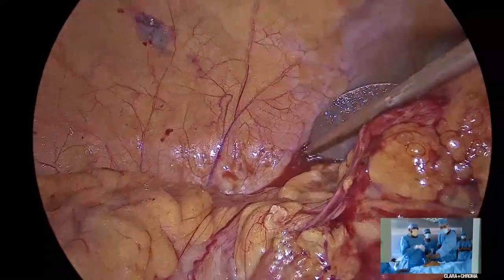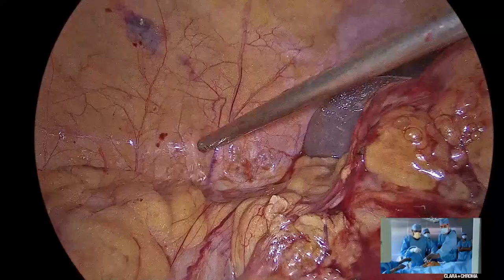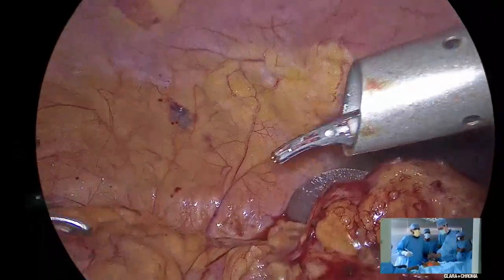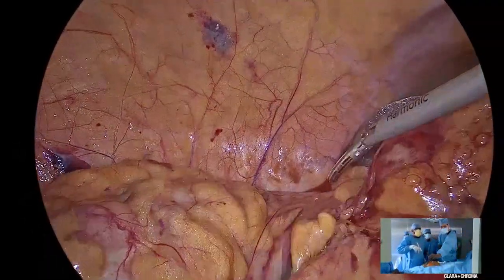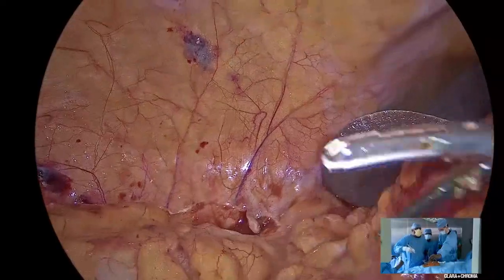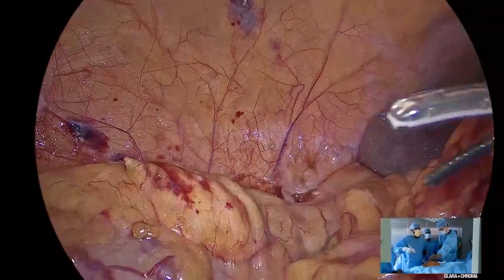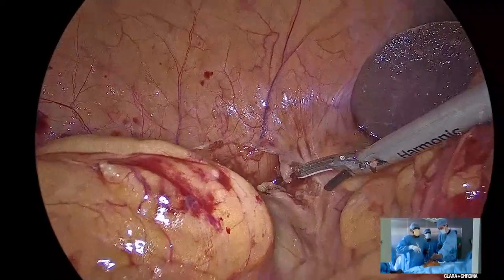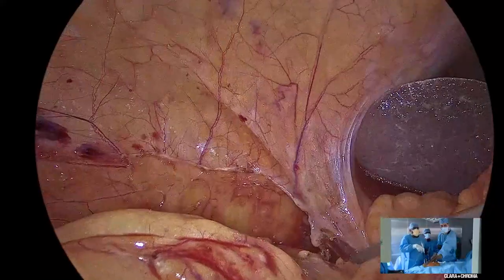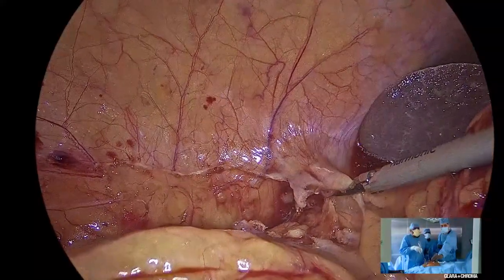Basically, we need to follow the embryonic planes, and we need to go in the fat planes between the SMV and the SMA. Go all the way up, get the colic branch of the gastrocolic trunk of Henle, and bring the transverse colon down, which gives you access to the uncinate process. Take all the fat underneath the uncinate process, and then complete your resection. But the ileocolic artery ligation is exactly at the point where we have just done. So we are okay as far as the vascular ligation is concerned, but in terms of getting out all that fat near the uncinate and SMV, SMA, I'm not too sure if that's going to be of any benefit to this guy.